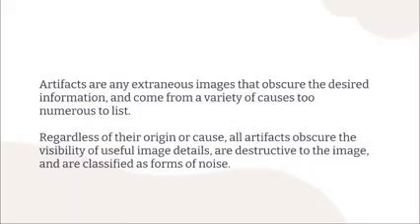But others include false images which are created by the tomographic movement of the X-ray tube. That means the X-ray tube moved while exposing the patient. If it is not the X-ray tube that moved, it's because of patient motion or other geometrical anomalies such as distortion, specifically magnification, foreshortening, and elongation, and static electricity discharges.